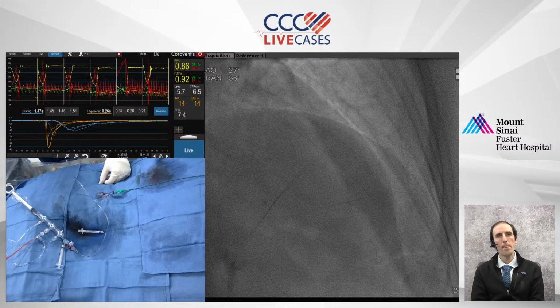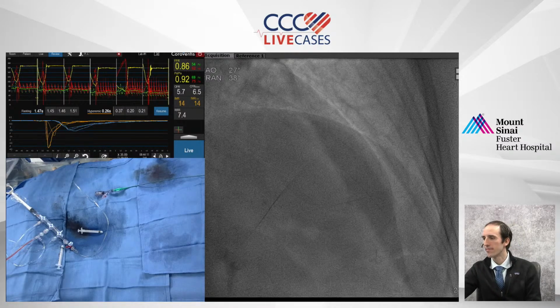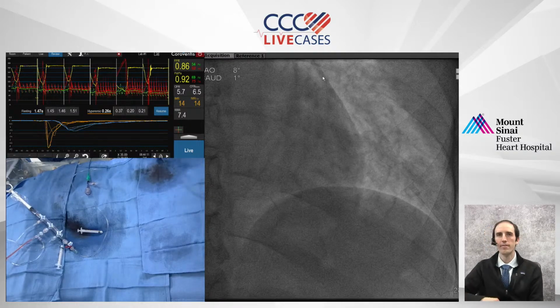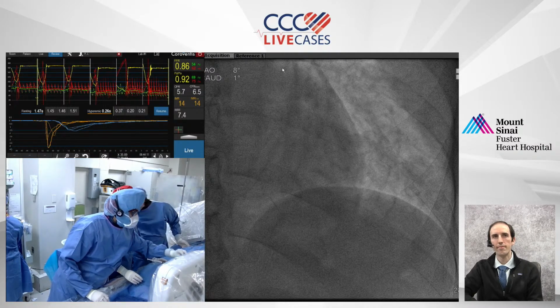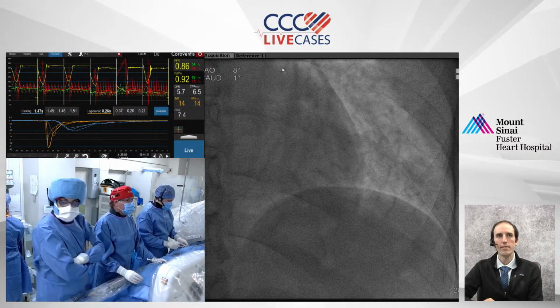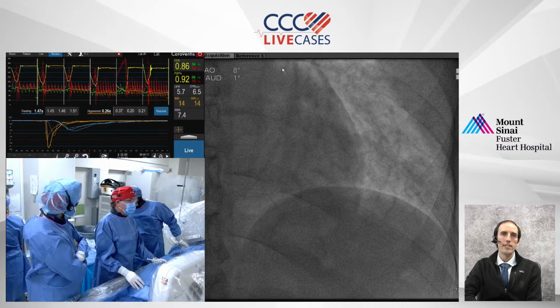And that's a whole other live case we could do. I think I want to keep things as simple as possible. For the audience, there is documentation of testing these with dobutamine here in the cath lab, and we have done it, but it correlates with proving ischemia non-invasively, but really doesn't add to the treatment of the patient. What about that point for discussion? Yeah, doing dobutamine in the cath lab for the FFR.